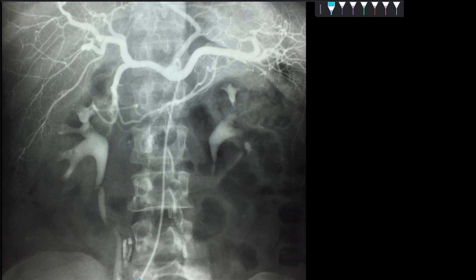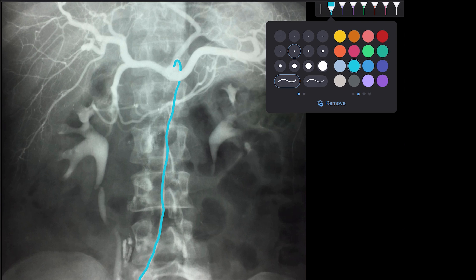We can see this is the catheter going up, and you can see here it is entering — this is my catheter and it is going into the celiac artery.